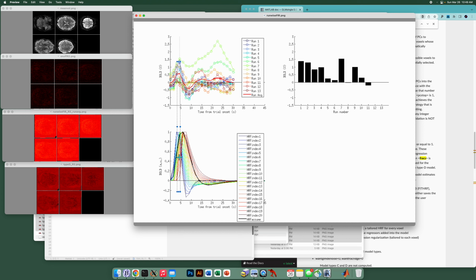So the bulk of the black time course extends about there, and it essentially covers some of the positive, but also some of this, it's already gone negative in the empirically observed time courses. So one hypothesis is that this mismodeling of the HRF as embodied by this black curve completely messed up the characterization of the data.